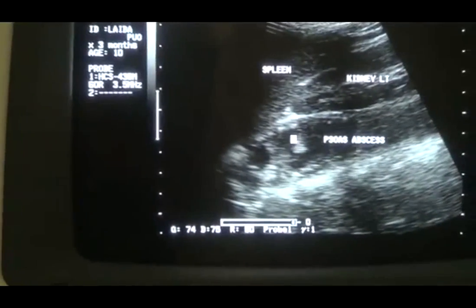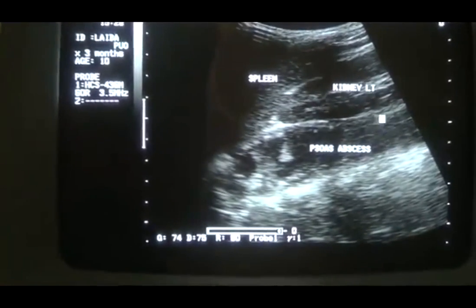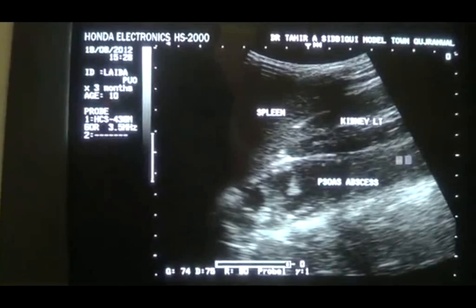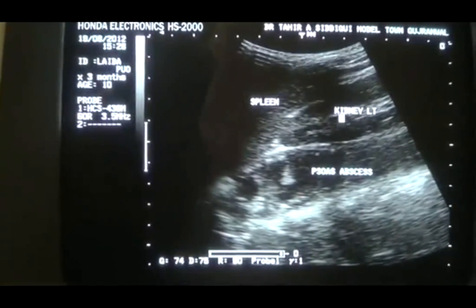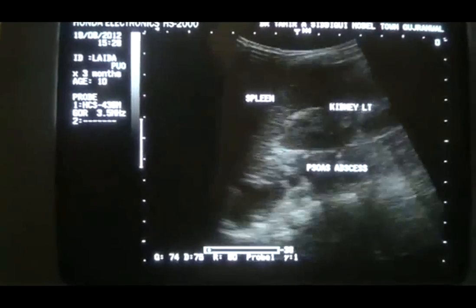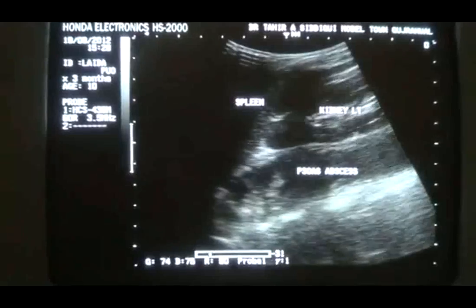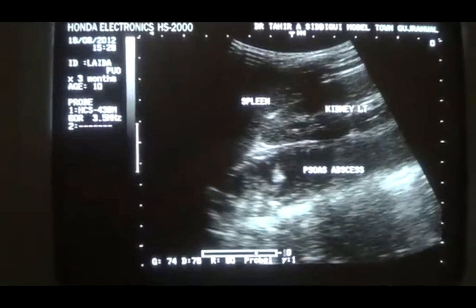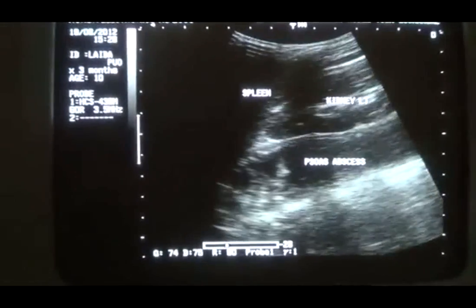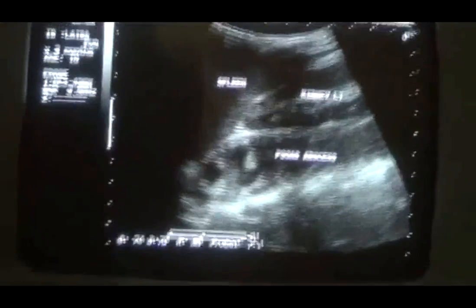And these are the echogenicities. These are the echoes within it. No psoas muscle is seen. It is seen in the region of the psoas muscle. The kidney glides on this cystic area. So this is a case study of PUO, and the cause that we have depicted by ultrasound is the left psoas abscess. Thank you.